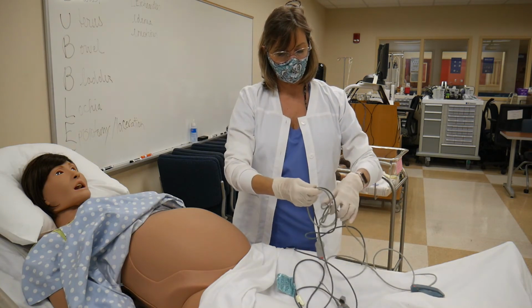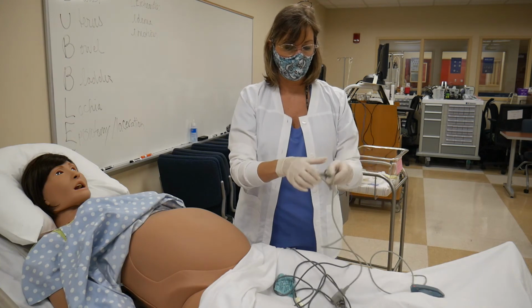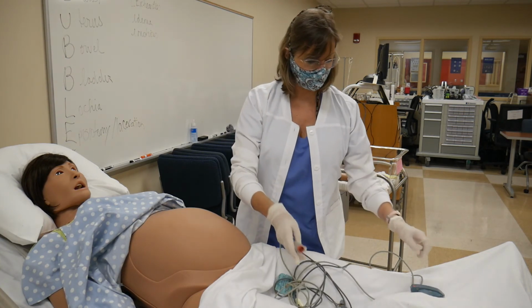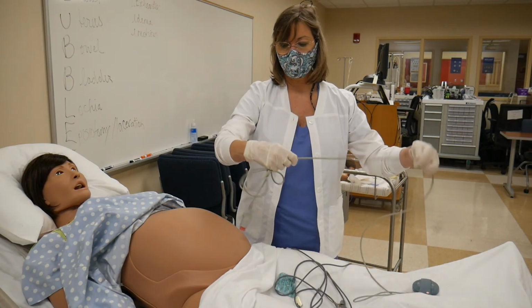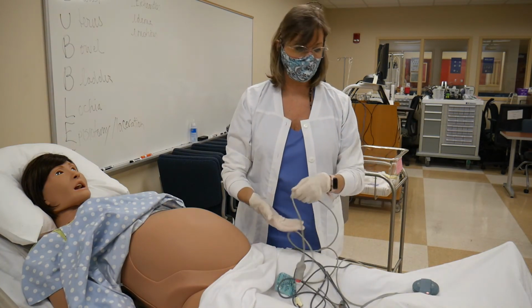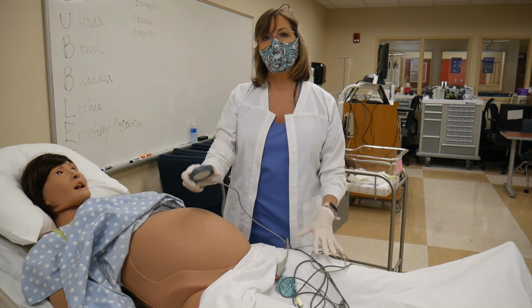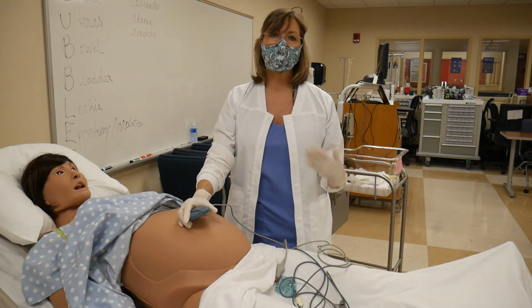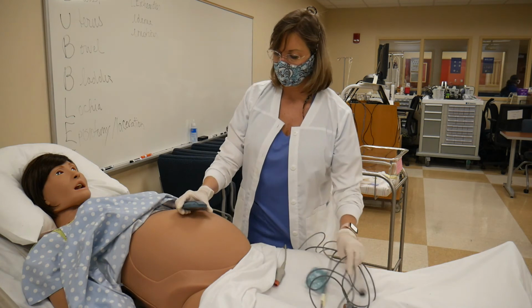So the first one we want to put on is the ultrasound for the baby's heartbeat. For one thing, that's the most important thing. If heart tones are within normal limits, then we can take our time doing the assessment and asking her questions and all of that. But if we put this monitor on and the baby's either tachycardic or bradycardic, that's going to change our plan of care, and we need to start doing interventions. We're not just going to stand around and talk to her for a long time.